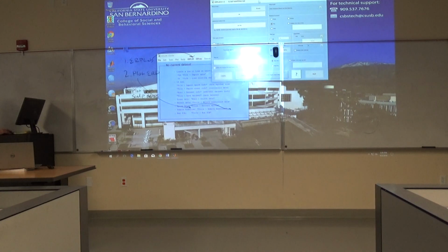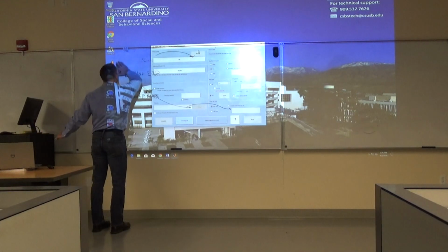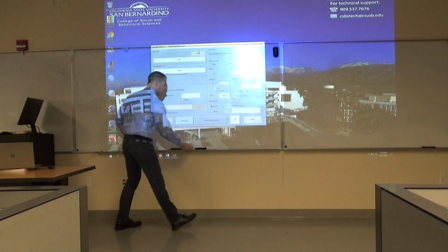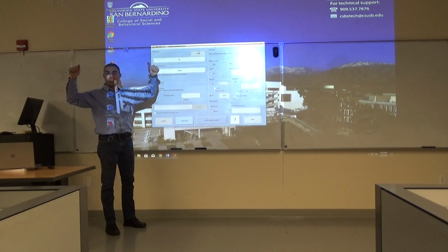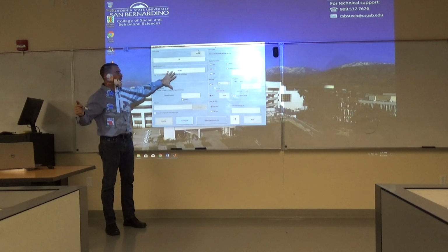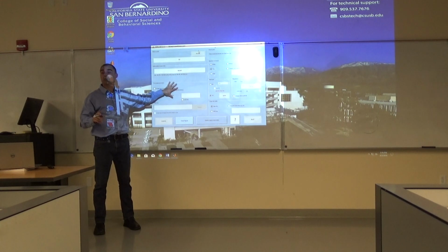Plots down here. Okay. So now you guys should have a menu like this. You good, Bethany? Awesome. Okay. So does everyone have a menu that looks like this? Does anyone not have a menu that looks like this?